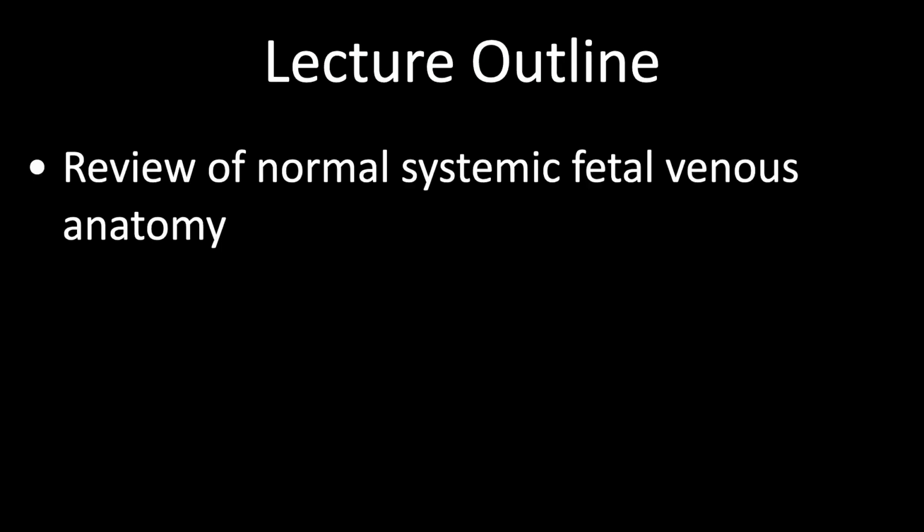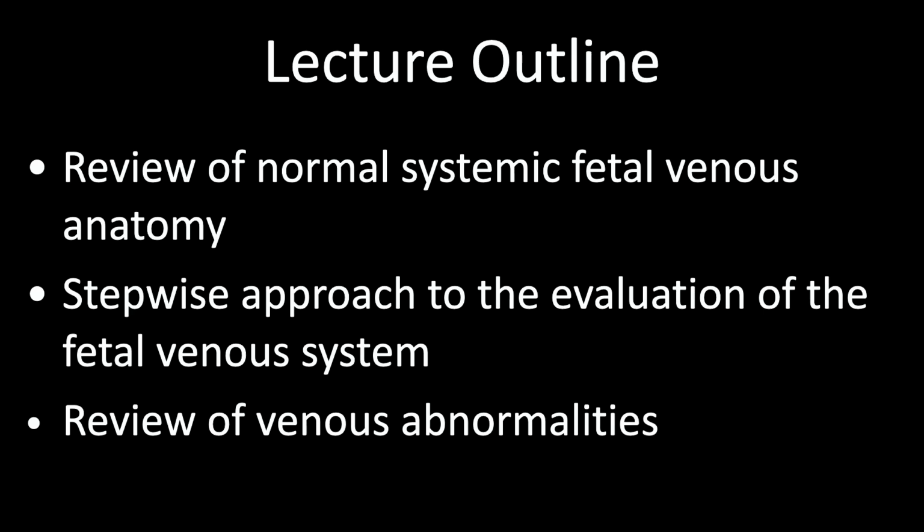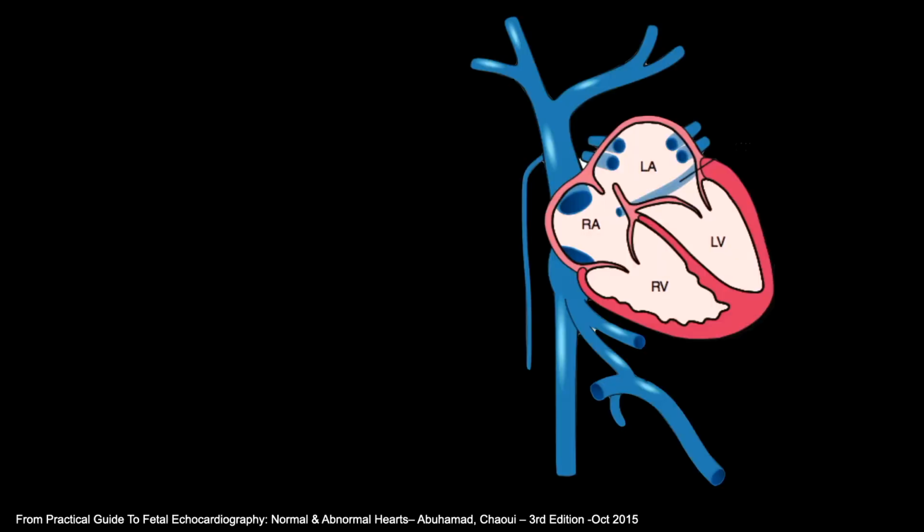So I'm going to review the normal systemic venous anatomy. I'll share with you a stepwise approach to the evaluation of the fetal venous system, and I'll review some venous abnormalities that are pertinent to your day-to-day evaluation.